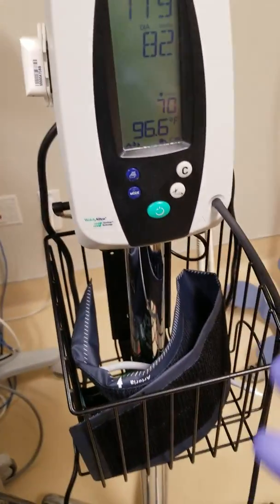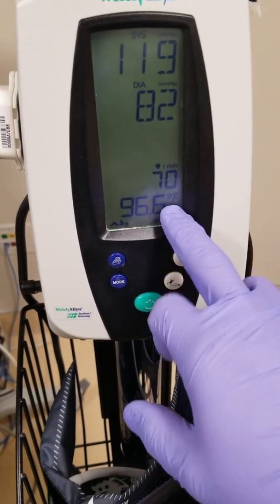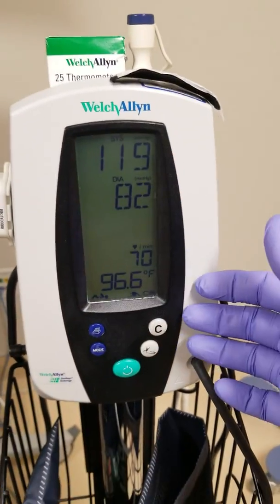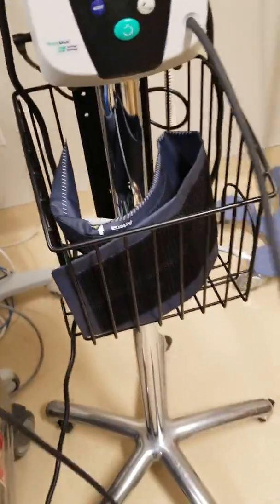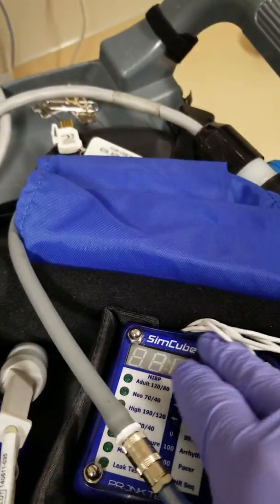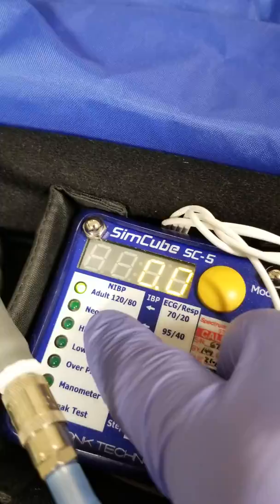Next, we're going to take a blood pressure reading. This unit's features are temperature and blood pressure only. I have my NIBP hose — this is a simulator we use, the Sim Cube SC5 — set to adult, 120 over 80.